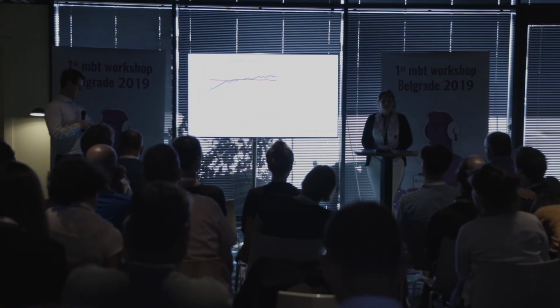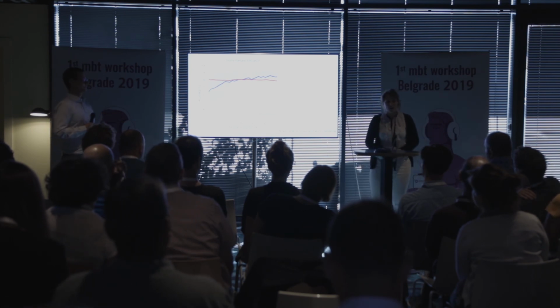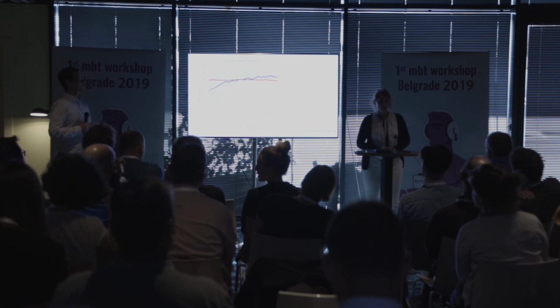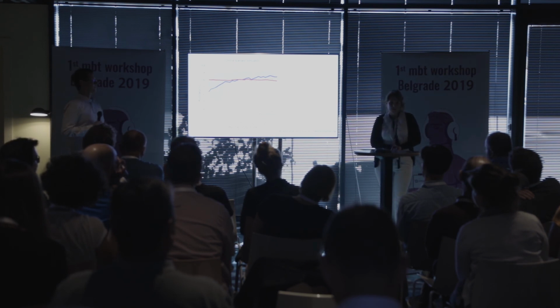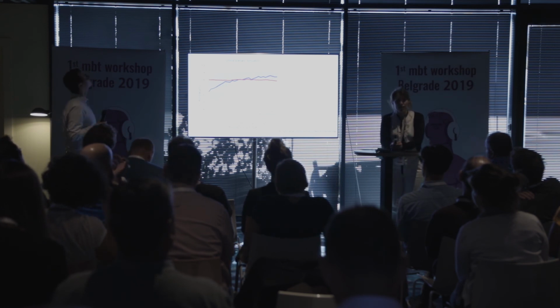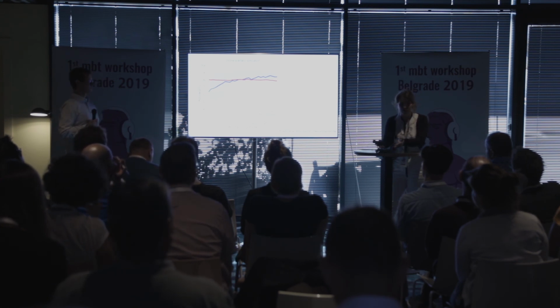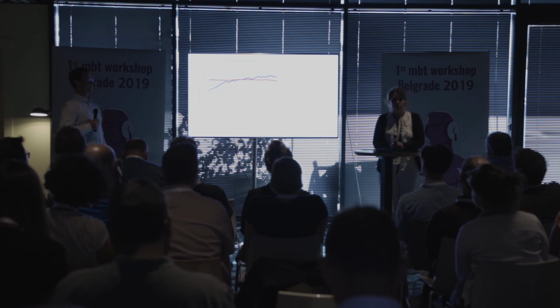This is not the case for neural networks. I can't tell you why, and that was a huge issue that presented itself at the conference in Leuven. That's something we need to look into. In general, it should be better if we use average decoders from other participants, but that reduces accuracy in the neural network decoder.